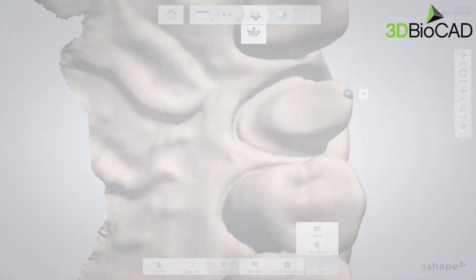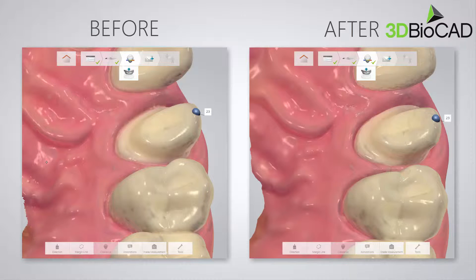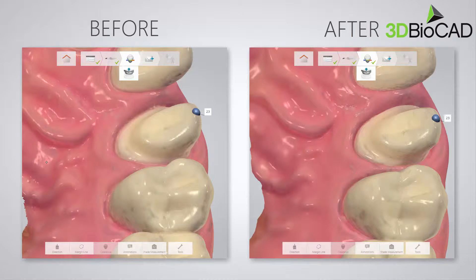When the case is sent, the entire scan is automatically reprocessed to reveal the full level of detail. As more time is available, the system may employ more advanced algorithms which will again bring out more detail. This way the lab will always have the maximum level of detail to work on.